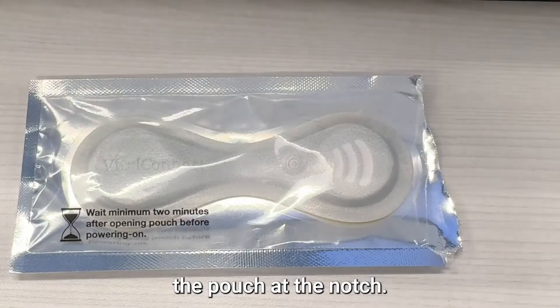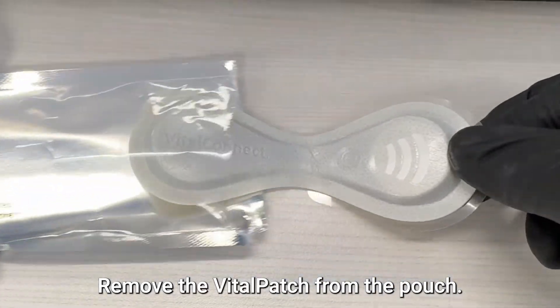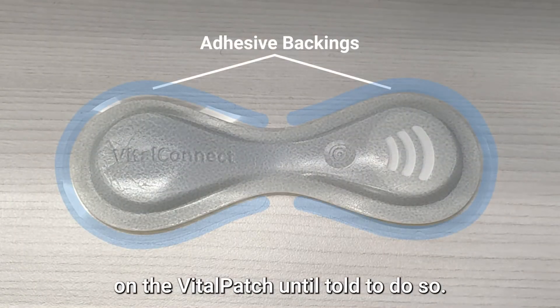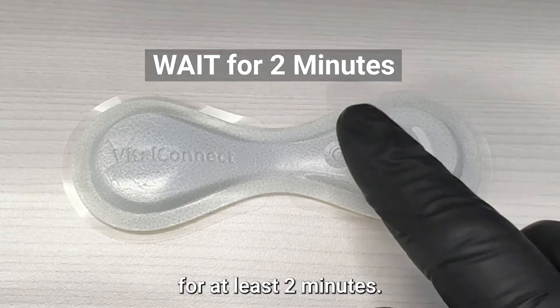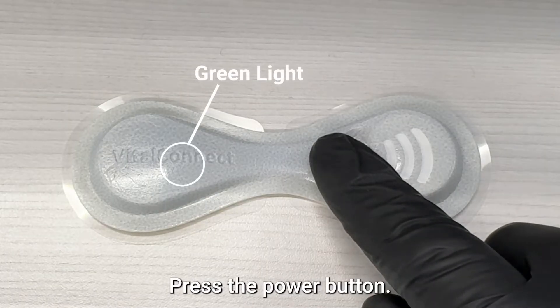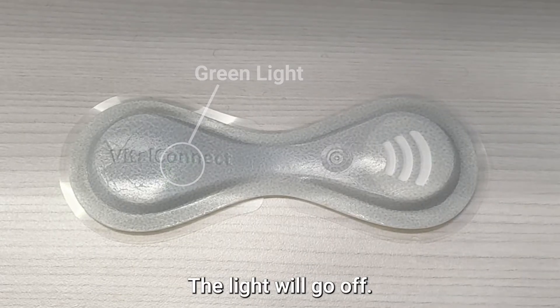Open the Vital Patch by tearing the pouch at the notch. Remove the Vital Patch from the pouch. Do not remove the adhesive backings until told to do so. Place the Vital Patch on a flat surface and expose it to air for at least two minutes. After at least two minutes have elapsed, press the power button. A green light shows the Vital Patch is on, then the light will go off.